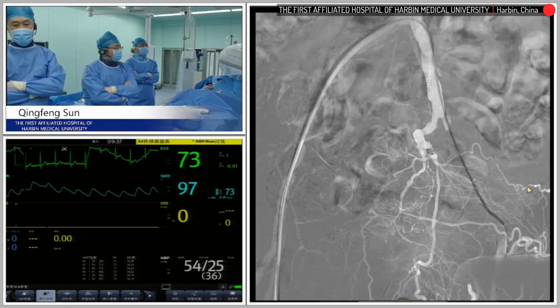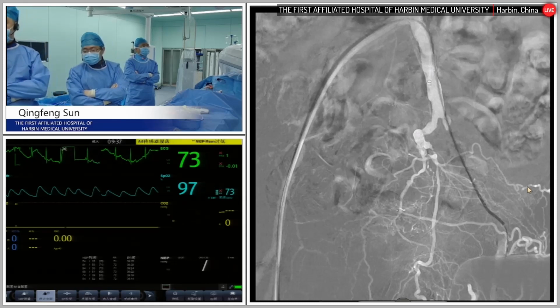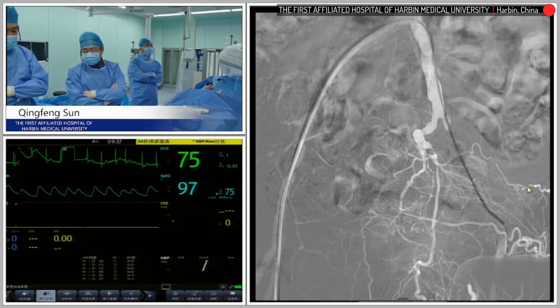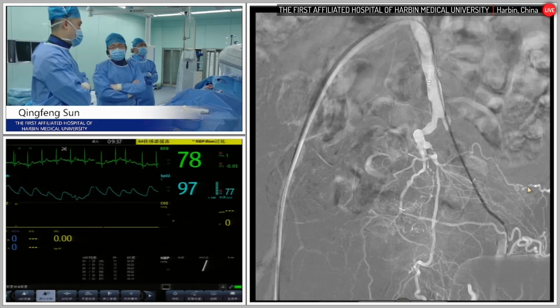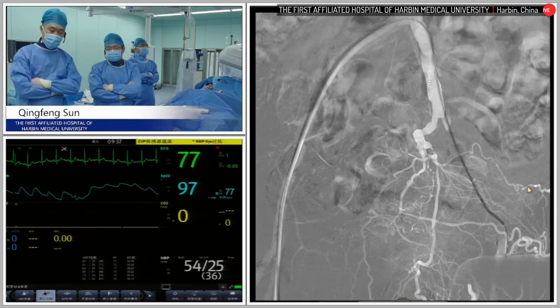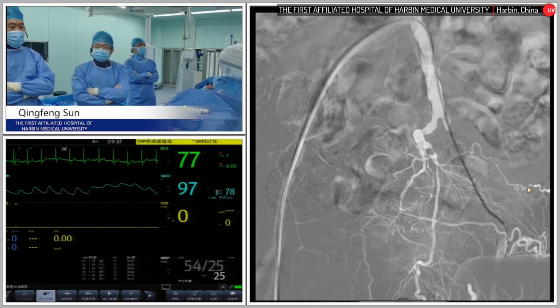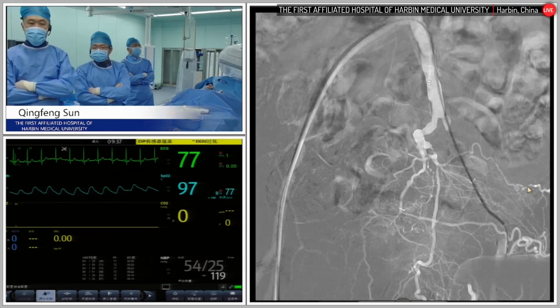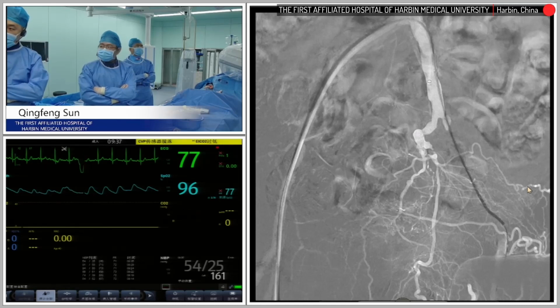Yeah, I know. And there's another question: how about the use of intravascular imaging for this kind of lesion, like IVUS or OCT? Do you have any experience doing this kind of imaging test? Using IVUS for the iliac artery. To be honest, we don't have the experience, and we are trying to show you the actual working situation for us in this department for now.